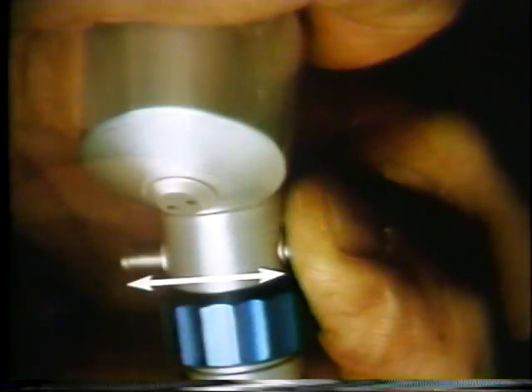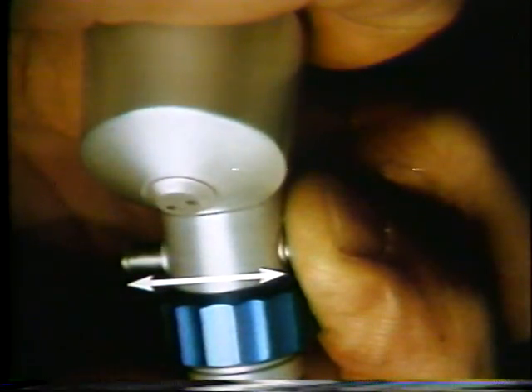The forward-reverse shifting lever also needs to be lubricated to prevent sticking. Place a drop on one side of the lever, then push it over to the other side and put another drop on the lever. Push the forward-reverse lever back and forth several times to work oil inside of the handpiece.